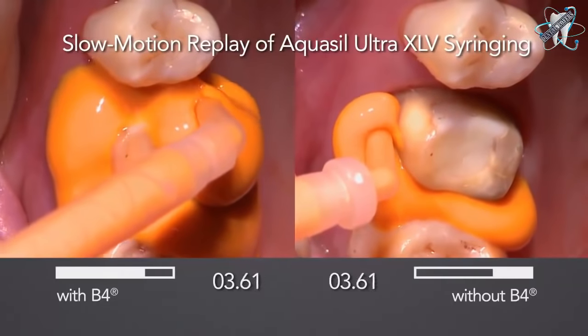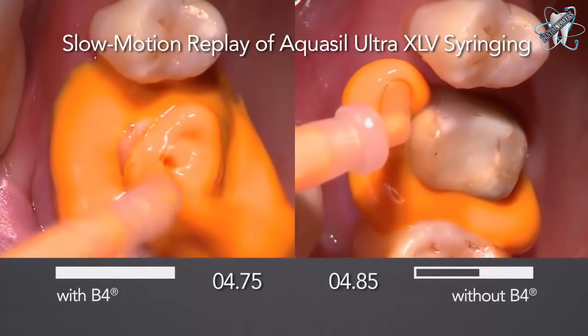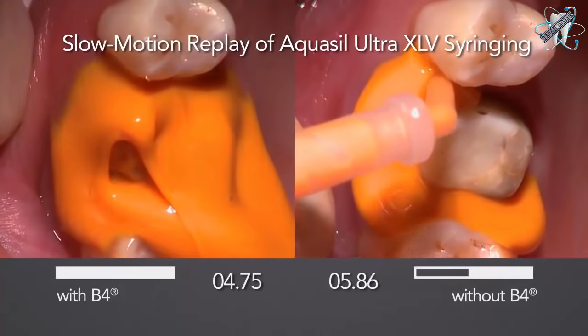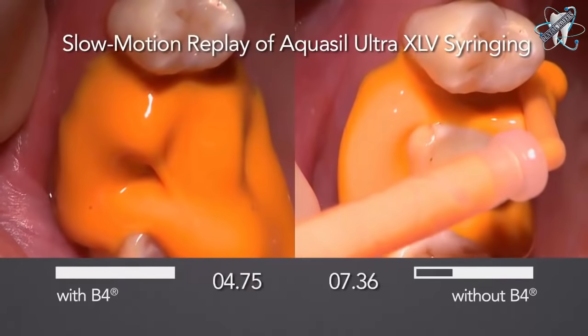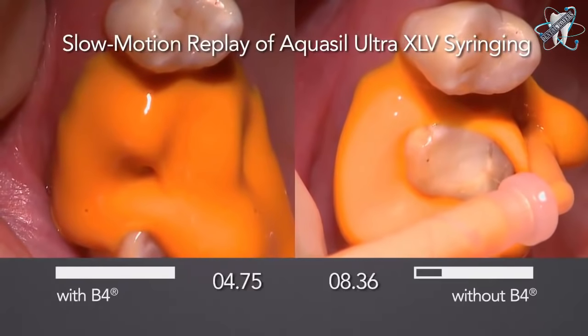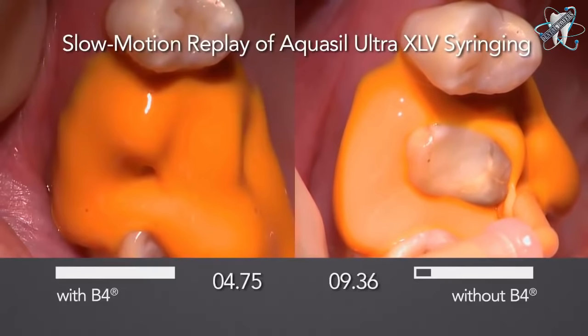Dentin, enamel, metals and gingival tissue each present differences in moisture, friction and surface tension. B4 reduces surface tension and allows the AquaSil Ultra wash material to flow into even hard to reach areas. Look at the difference. The combination of B4 and AquaSil Ultra XLV provides predictability and peace of mind.